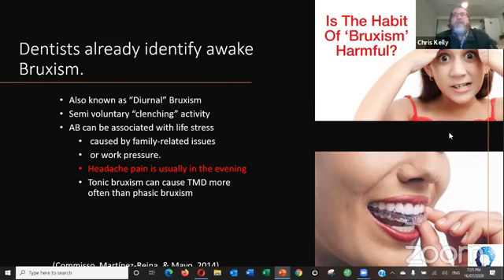The detection of bruxism has become quite systematic, which makes it easier for us to look at RMMA and see, is that bruxism, or is that myoclonus, or is that just snoring? Is it just facial movement from somebody who's snoring 80% of the night? You've seen a few sleep studies of late where that's just been obvious.